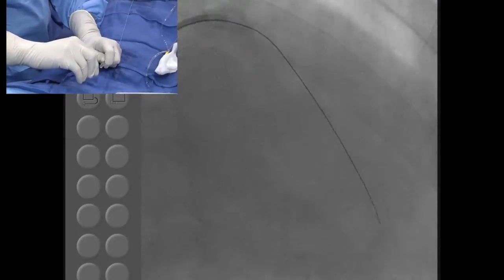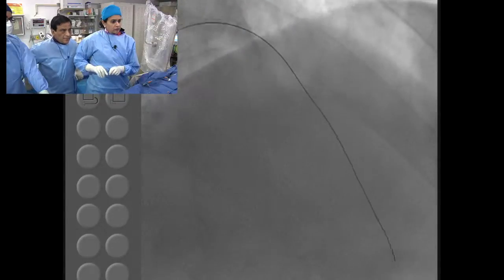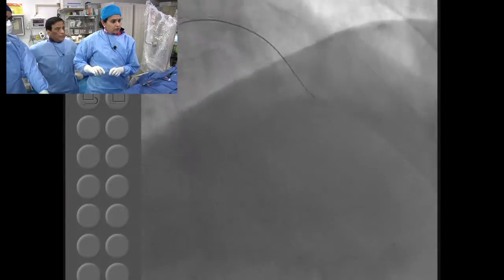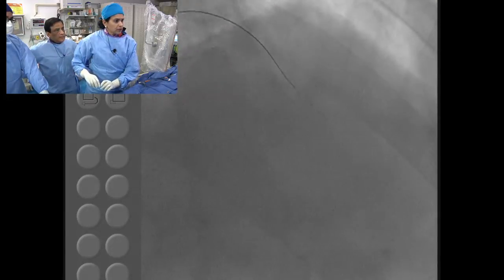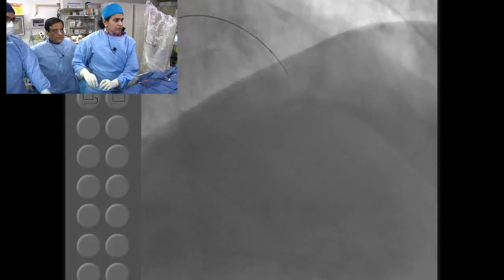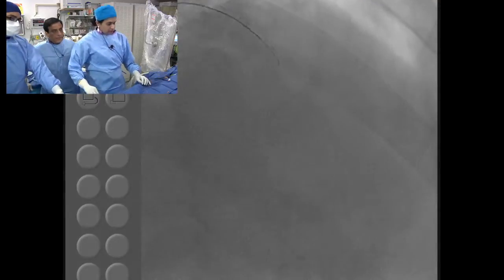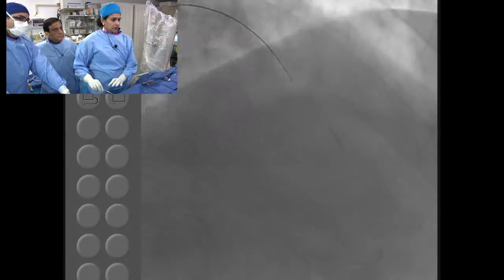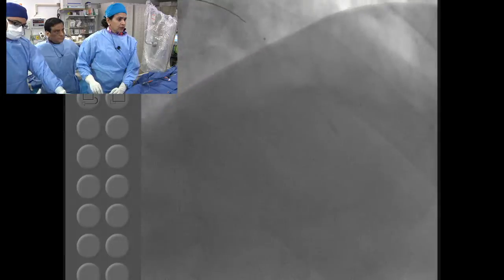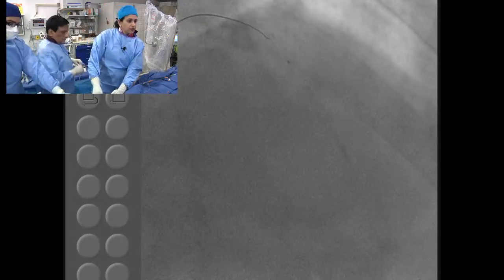Remember in these cases, once you went subintimal and you think it's not a true lumen, you give them a gap of 6 to 8 weeks and bring them back. It becomes much easier, could be a straightforward job after that. When the wire gets stuck in the area, that means a lot of subintimal. You want to go with the Fielder, Whisper? No, with your 200. Do you want to see a little dye? Antegrade. See there? A lot of subintimal. Take a cine, then we decide which wire.